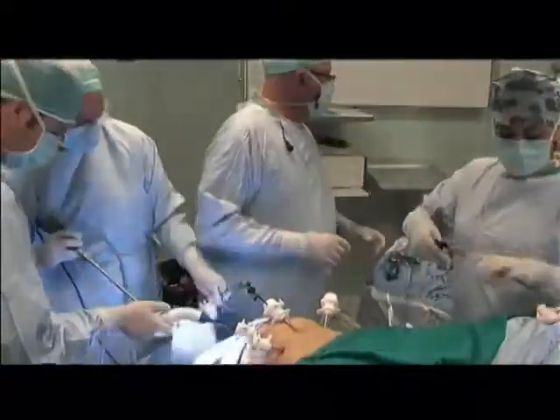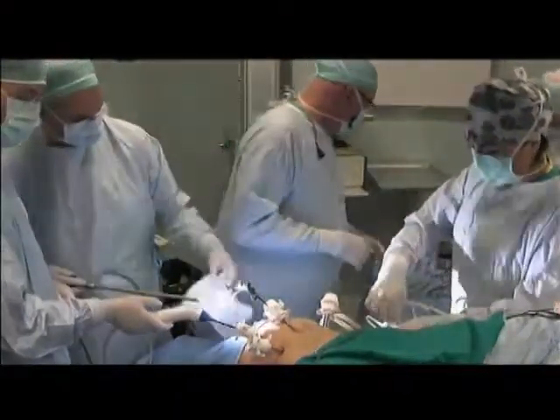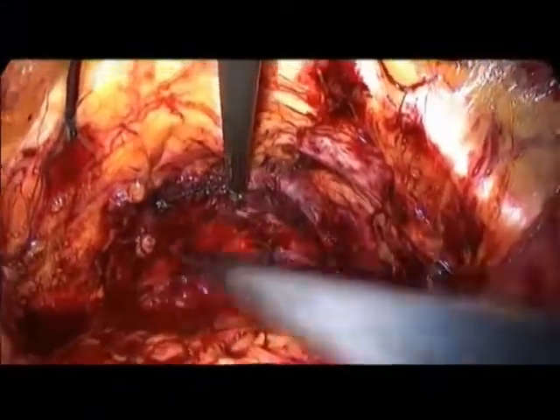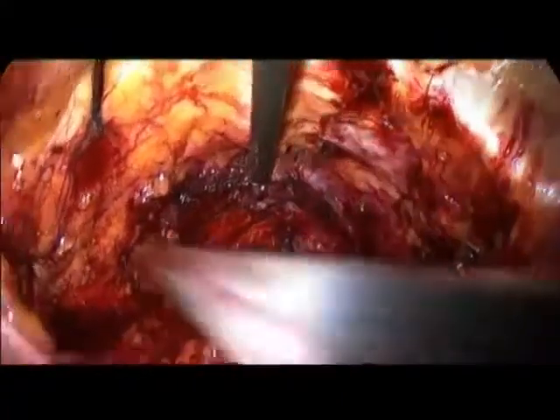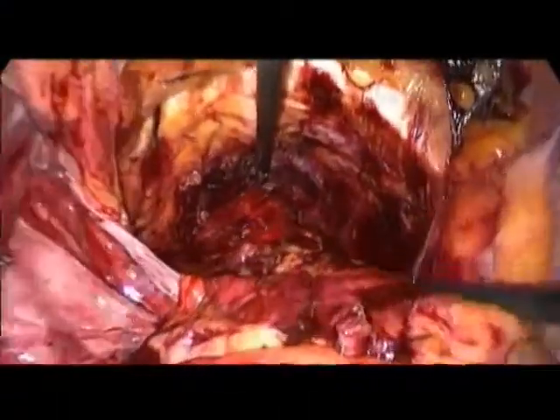You didn't do the bladder neck yet. No. Here is the stitch. Try to see with one knot and the same color of the thread. But this is not biosin. No problem. If it's okay, we do it now. Prepare now, 20-20. Yeah? Okay. Prepare 22, so that we are safe in any case. And the second needle holder. Thank you.